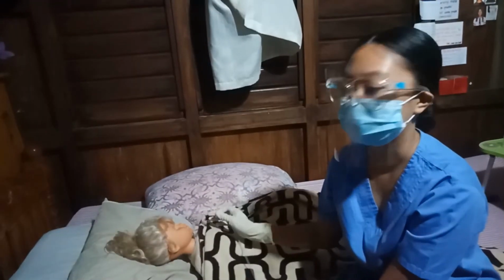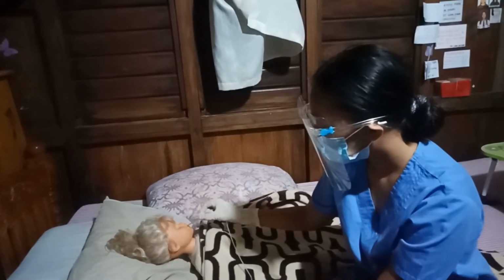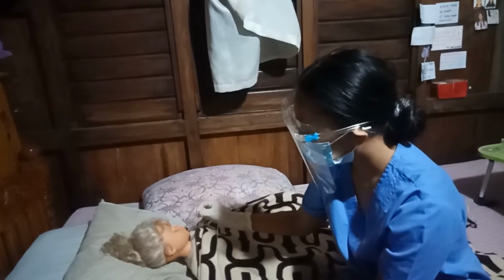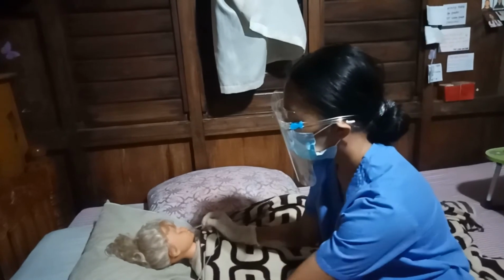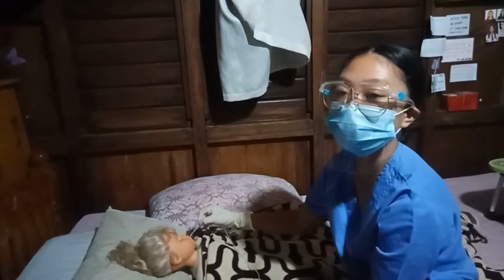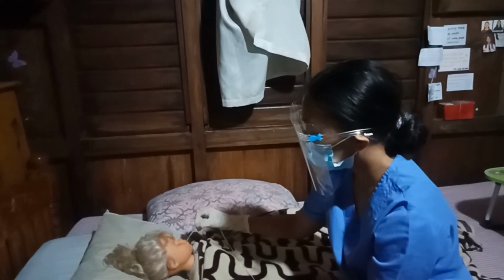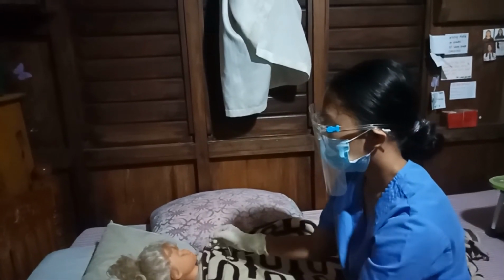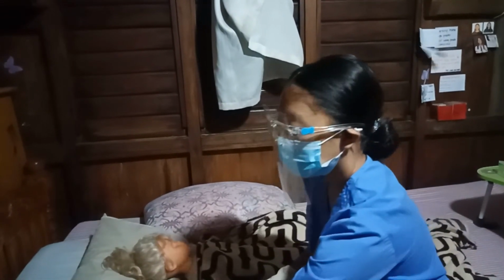After 30 seconds, we need to suction also the oropharyngeal of the newborn. So assume that I am inserting also. This is the side of the mouth. Side insert. Then suction. And again, at the side, under or at the side of the tongue. Okay. Suction. Okay. Then monitor the baby.